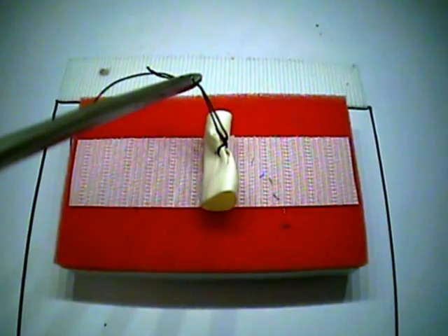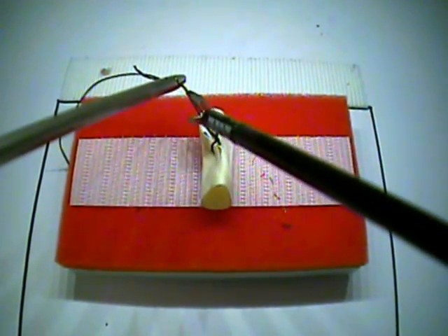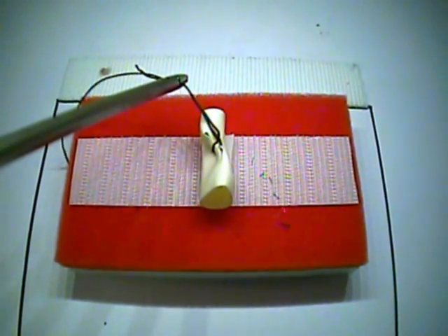change your right-handed needle driver for a scissors, and cut the stitch to complete the exercise. The time stops once the stitch is cut.